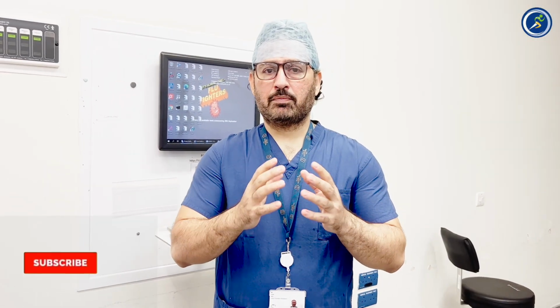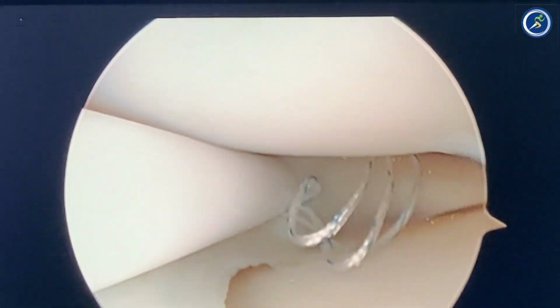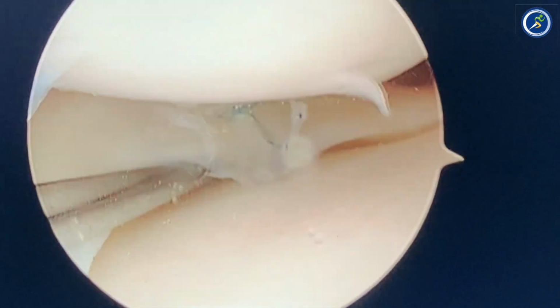Okay, so the purpose of showing this video was from the beginning to show you in a young guy how a meniscus tear is treated. As you can see, we went inside, we repaired the meniscus, and we have saved this meniscus to prevent him from future arthritis.